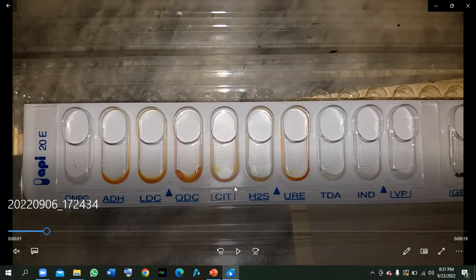So what does this basically mean? This means that when we inoculate our sample into these wells, first we have to fill the wells up to this portion. Just look at my cursor. We have to fill our wells up to this first portion.